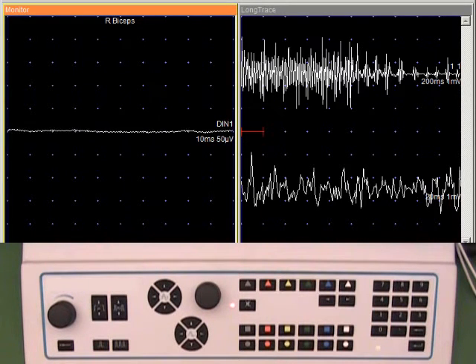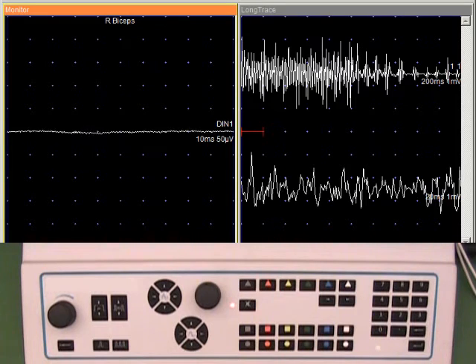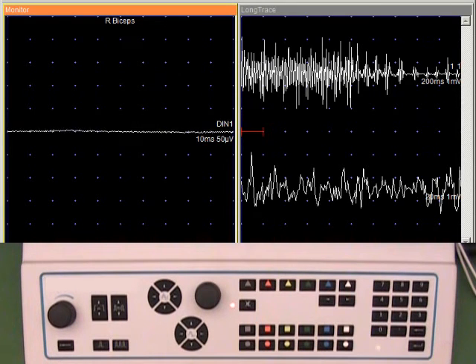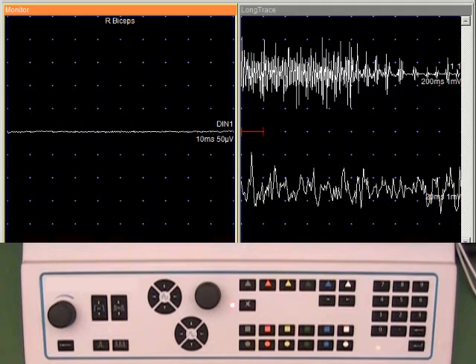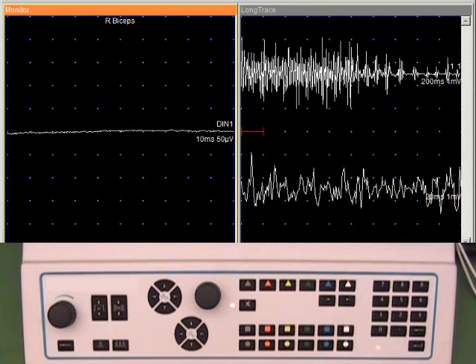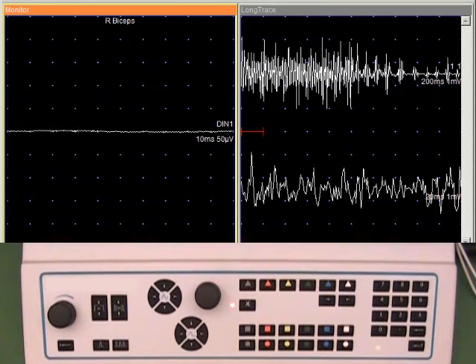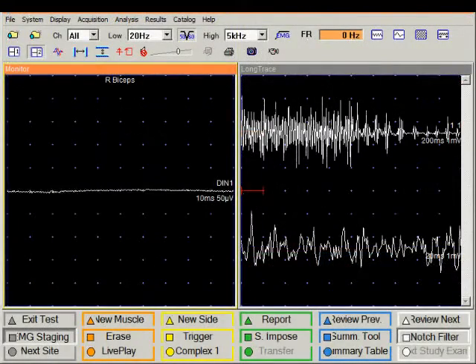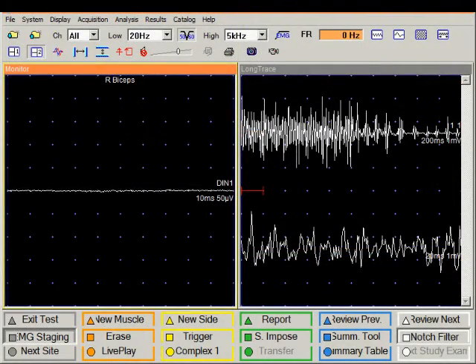In this way we can very nicely and objectively assess the insertional activity, spontaneous activity, motor unit potentials, and the recruitment pattern at maximal effort. The final process is to score these findings.